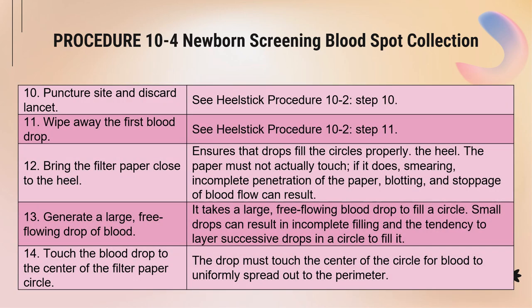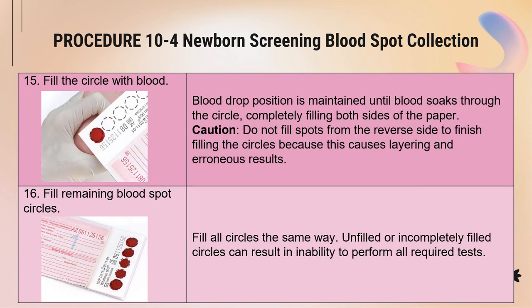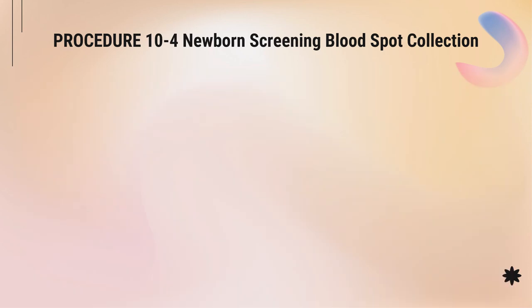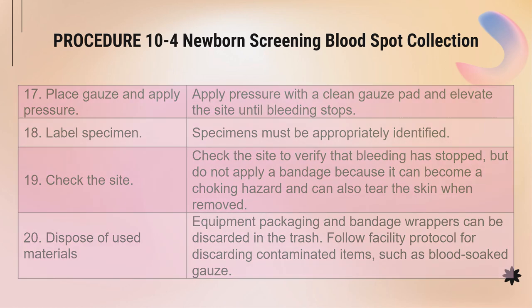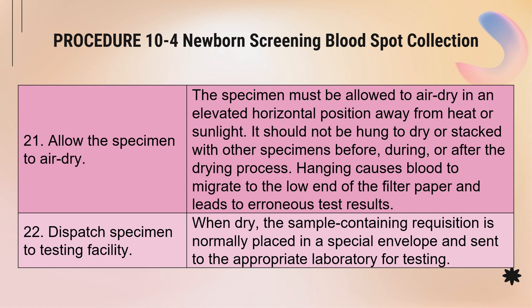Now we go to step 12, bring the filter paper close to the heel. Then step 13, generate a large free-flowing drop of blood. Step 14, touch the blood drop to the center of the filter paper. Then 15, fill the circle with blood. Then 16, fill the remaining blood spot circles. Seventeen, place the gauze and apply pressure. 18, label. 19, check the site. Again, for 5 minutes. 20, dispose of used materials. 21, allow the specimen to air dry. Then 22, dispatch the specimen to a testing facility.